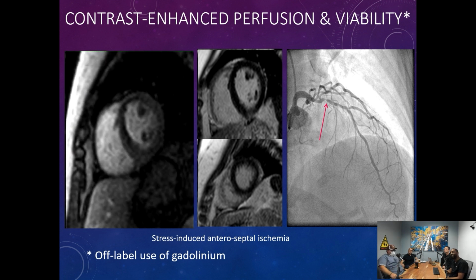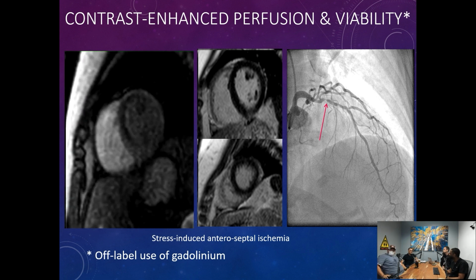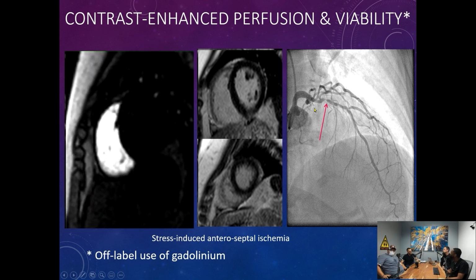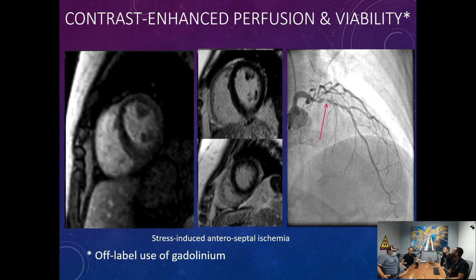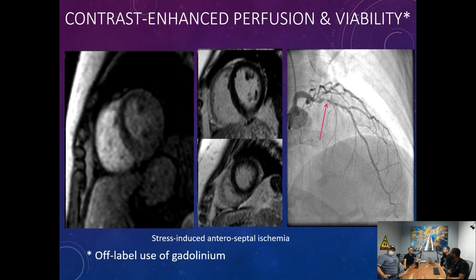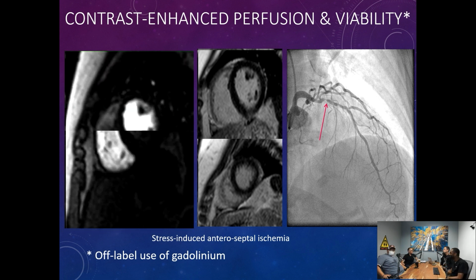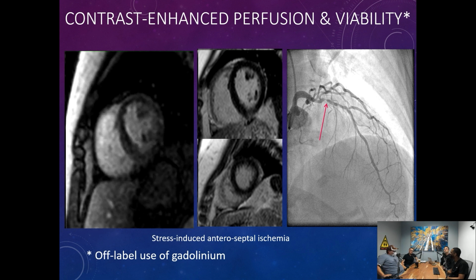Right. So the key technical aspect with an inversion recovery sequence is that you should image every second beat. So every 2 beats, you need to let the signal recover. That's a good point. So you can't do it every heartbeat. So if you're analyzing or if you're doing it for the first time, that's one setting. Usually the vendors have it properly adjusted, but it's a little trick. It's important not to forget.